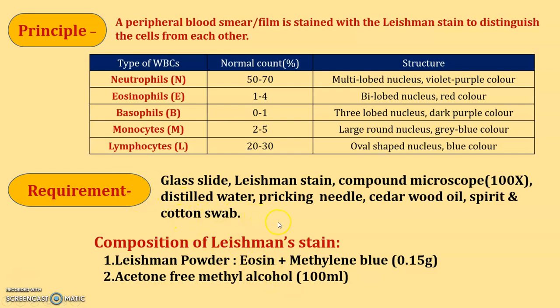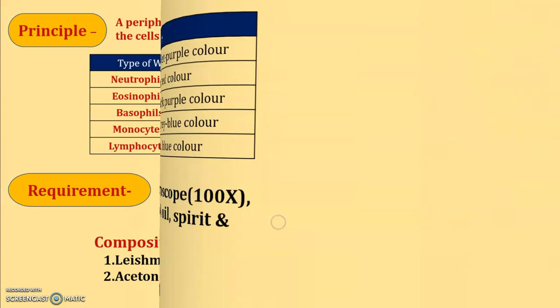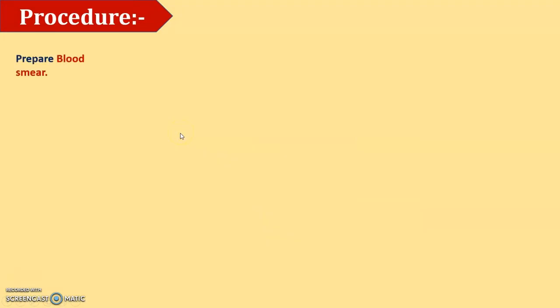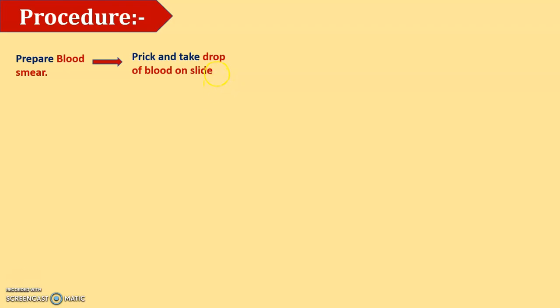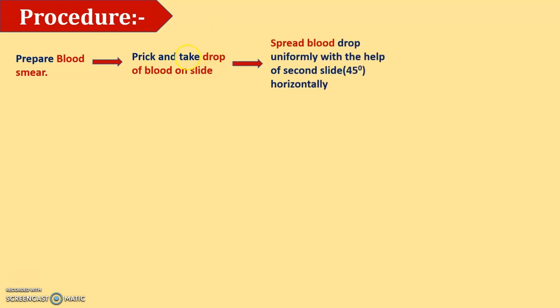Now let us discuss the procedure. First, we prepare a blood smear. Prick the finger with a pricking needle and take one drop of blood onto the glass slide at any corner. Then spread that blood drop uniformly with the help of another glass slide at an angle of 45 degrees, ensuring it is neither too thick nor too thin.